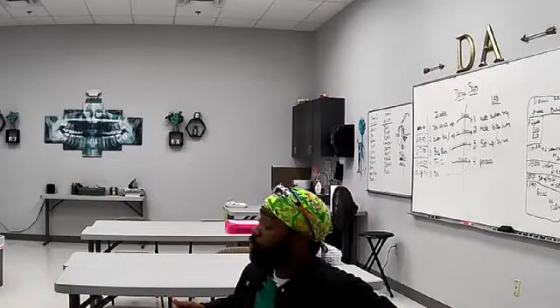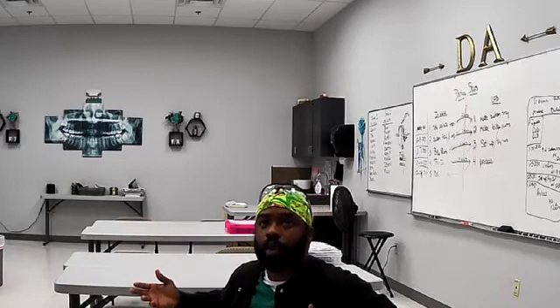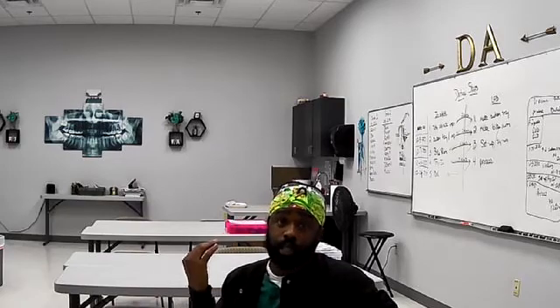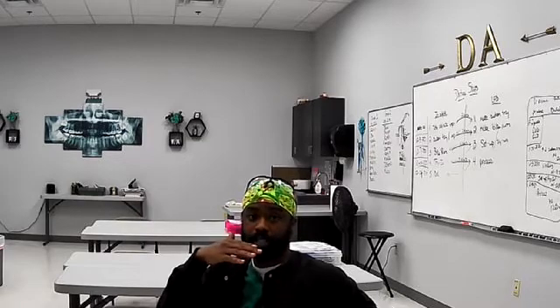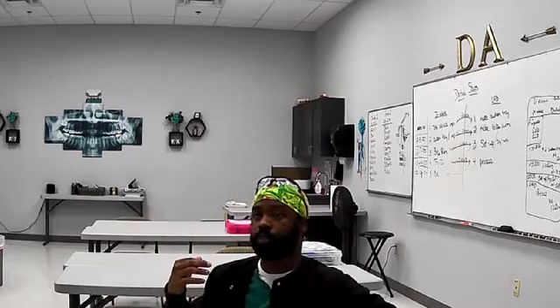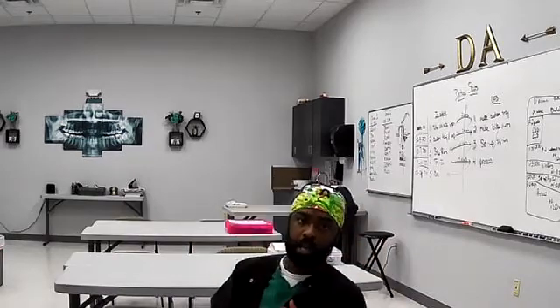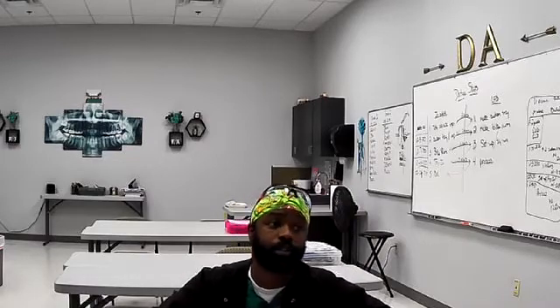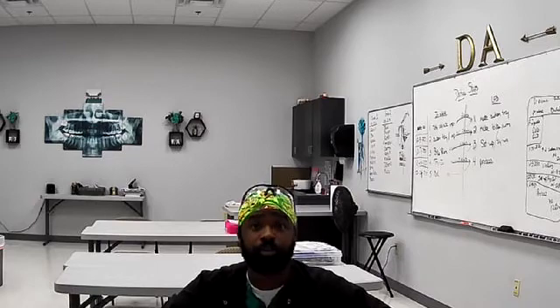If you were to take a pano on mixed dentition, a child that's 9, 10, 11, who has a lot of permanent teeth but may not have lost some of their primary teeth, you're going to see all of this in that one photo. You'll see the baby teeth, or the primary teeth, first, and then above is where you would see your permanents, whether they have already erupted, are ready to erupt, or are in different stages, like budding and developing. You can see all of that. You can also see bones. Make sure you always take off your jewelry, especially if it's metal, because that's going to show up in a pano.